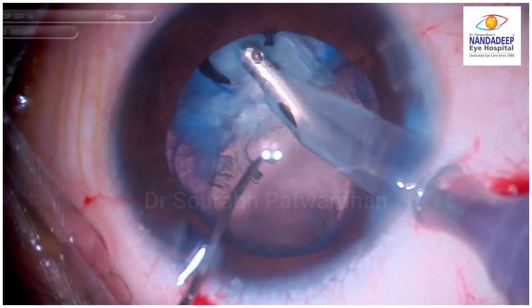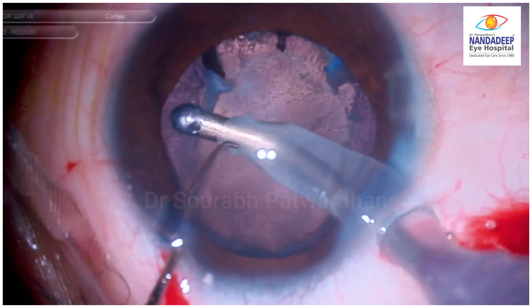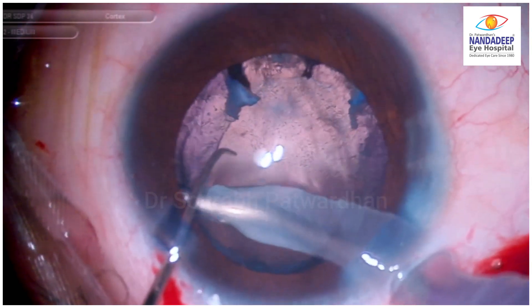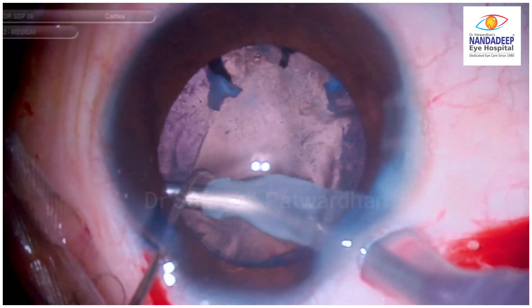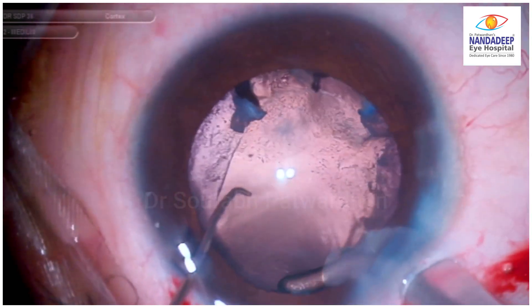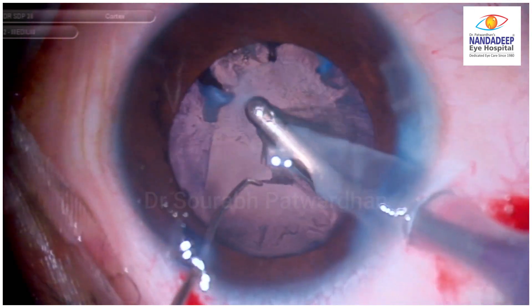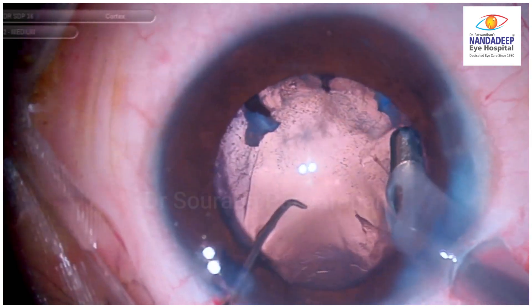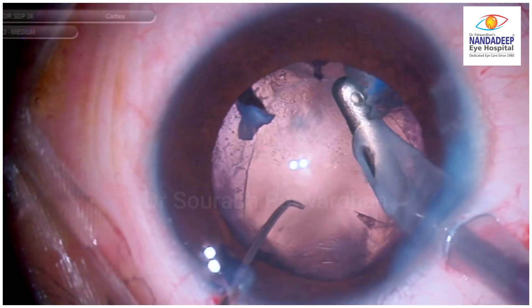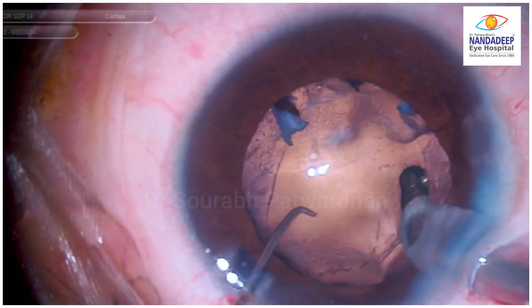If we use very high bottle height or high IOP and there is a small tear, it might just extend and you may have vitreous prolapse. This low IOP function definitely helps. With gravity-based machines you can keep the bottle height low and use low vacuum and flow rate to achieve a similar advantage. During capsular polish you have to be really careful not to pull on those open capsular tags. Keeping the posterior capsule intact gives much more advantage than removing all cortex.